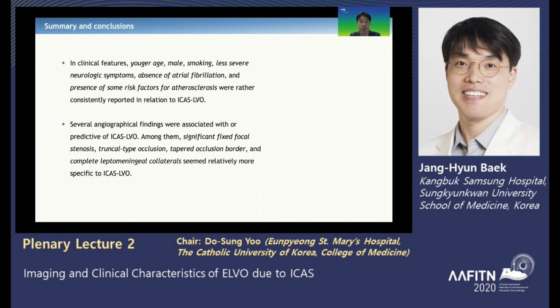Among several angiography findings, significant fixed focal stenosis, truncal type occlusion, tapered occlusion border, and complete leptomeningeal collaterals seem relatively more specific to ICAS LVO.